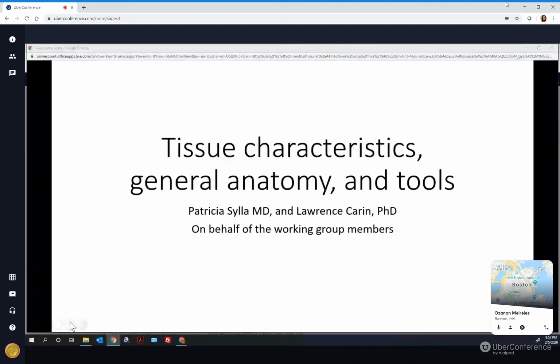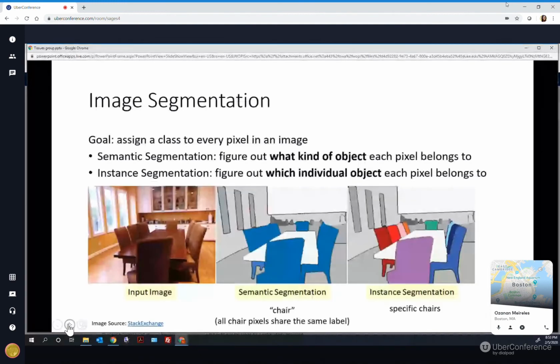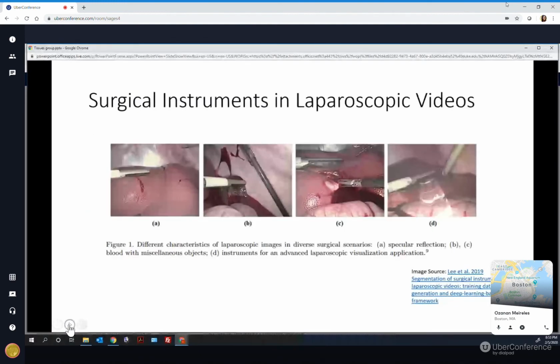And if I train the machine to see, like, doing this inguinal repair, closing the defect of the hernia, imagine then that I can actually extrapolate and move this to the upper abdomen, when I'm doing another type of hernia that closes the hiatus for reflux, and I don't need to be training the machine on suturing again. So that's the idea of breaking this down into building blocks of Lego, like we discussed today with the actions and tasks. Can we transfer the actions and the tasks to different parts of the procedure? Yes. Also, could it transfer the actors we have in the abdomen to different types of procedure? And the answer should be the same.